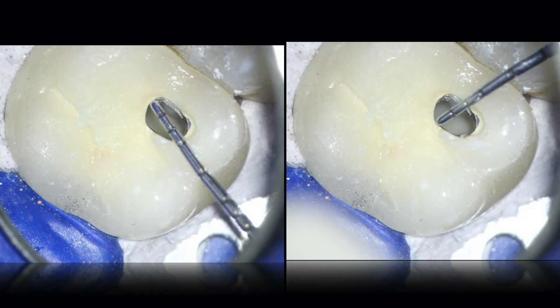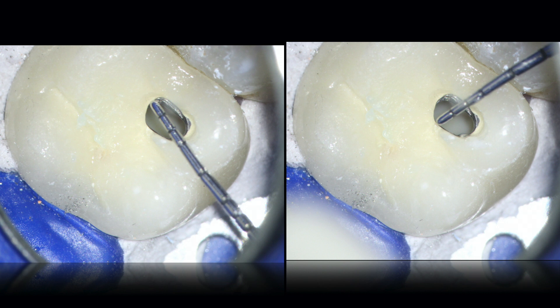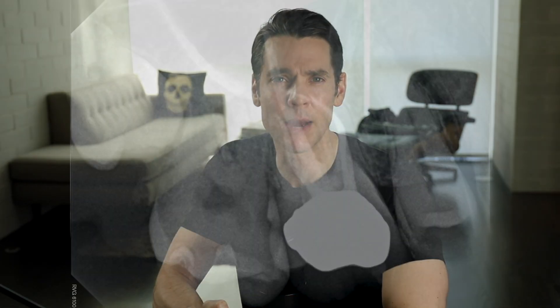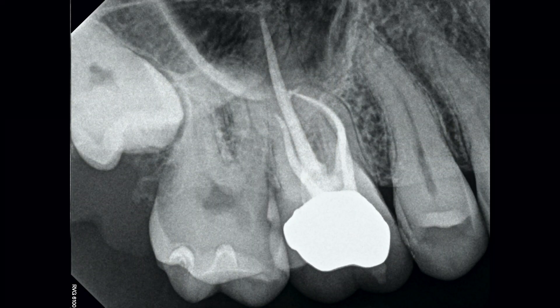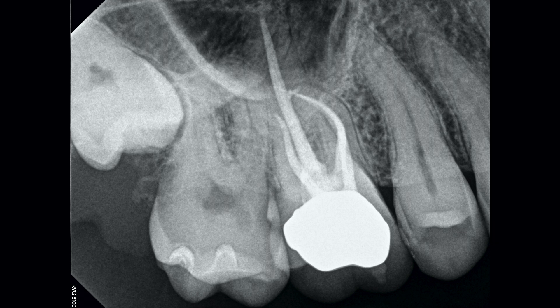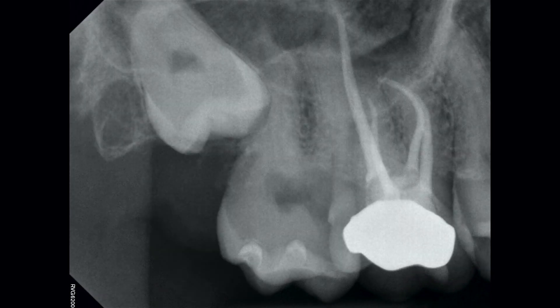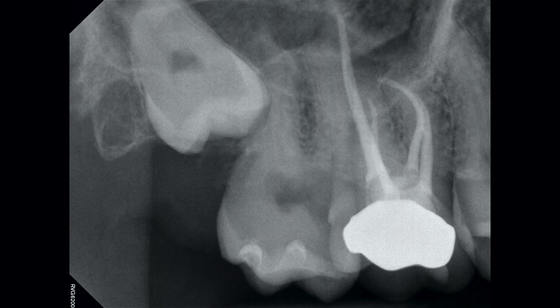This approach does a wonderful service for your patient. We kept the access extremely conservative, targeted our treatment just for that mesial buccal root complex, and accomplished everything we needed to with the help from the information on that cone beam scan. This is our final post-operative image — we can see a well-treated mesial buccal root complex. I always encourage at least two post-operative images to demonstrate all canal systems: a straight-on and some sort of angled view either to the mesial or to the distal.